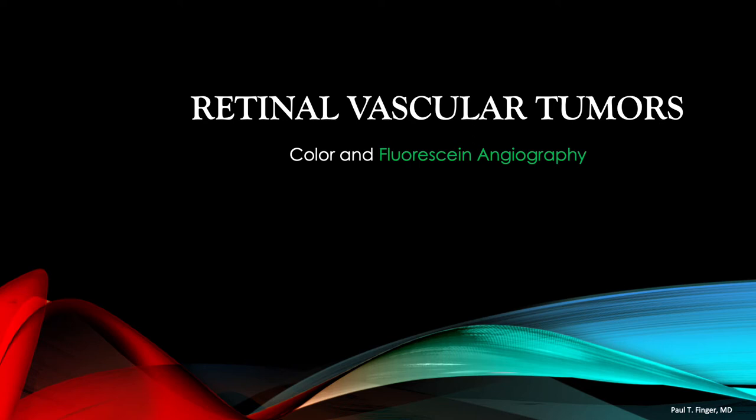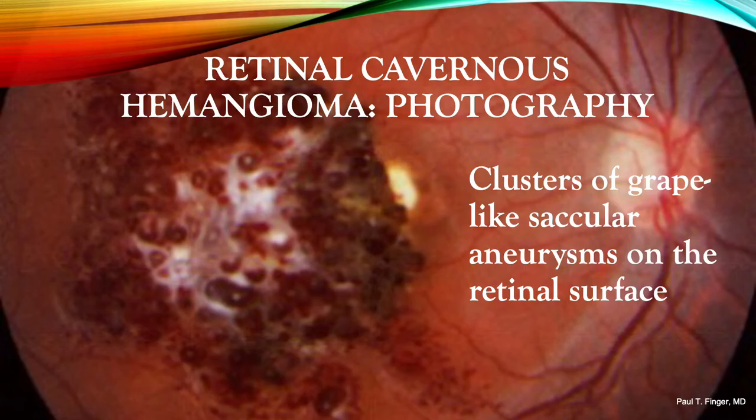Because they're retinal, we don't use indocyanine green angiography. Retinal tumors are typically seen anterior to the retinal pigment epithelium, so their surface and intrinsic vascular patterns are easily viewed. You can see why retinal cavernous hemangiomas have been described as a cluster of grapes — these grapes are actually large, low-flow, saccular aneurysms.